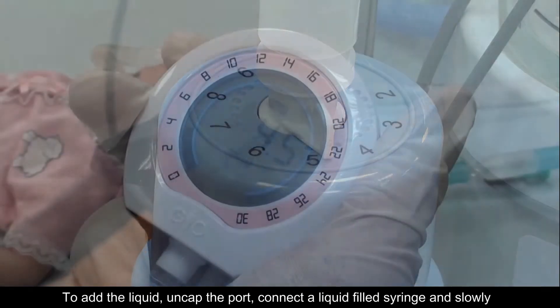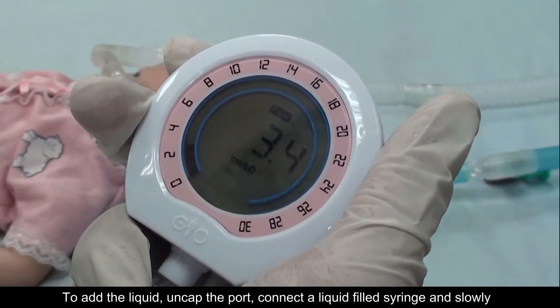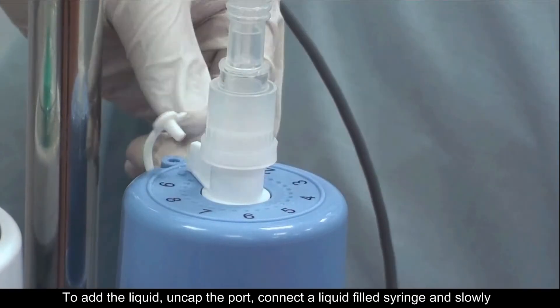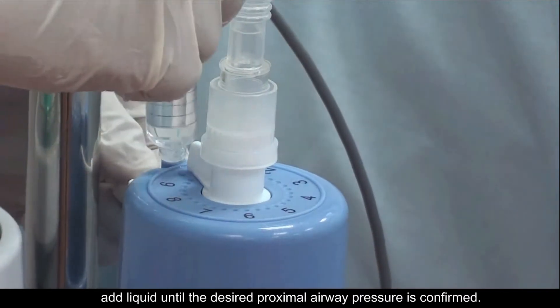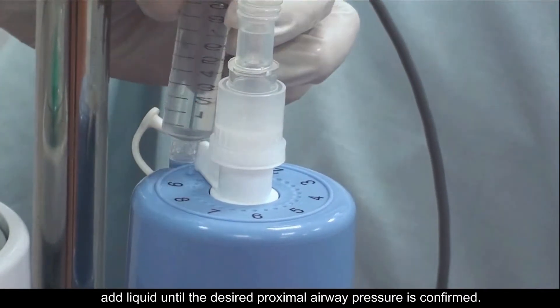To add the liquid, uncap the port, connect a liquid-filled syringe, and slowly add liquid until the desired proximal airway pressure is confirmed.